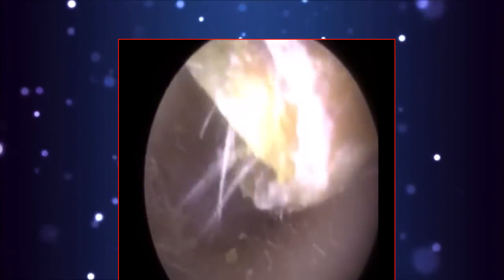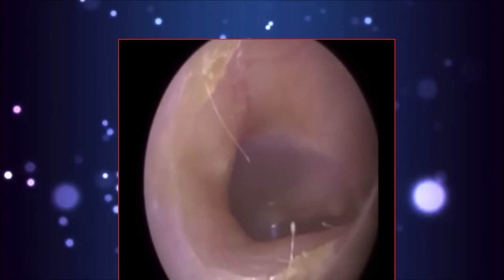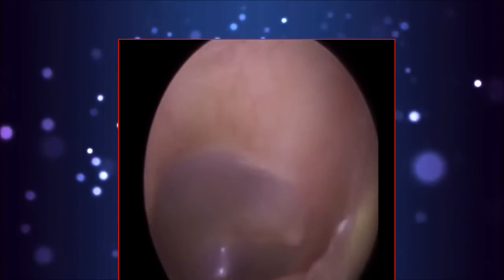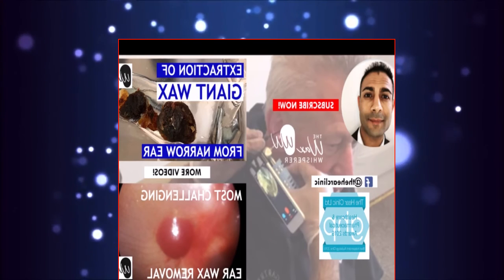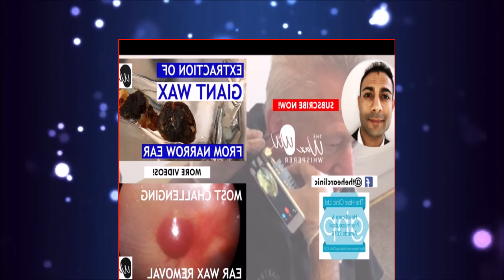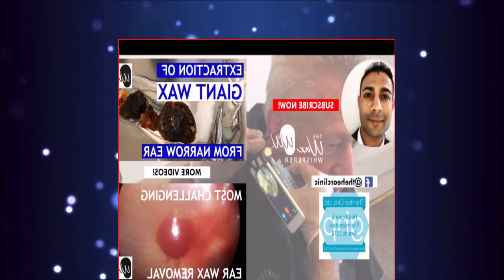So we're not only having to enter a very small chamber, a very small orifice. Remember that the Zollner suction probe is 2mm diameter. The endoscope is 2.7, so that's almost 0.5 centimetre already. So we've only got a couple of millimetres here and there, give and take, and then the ear's bendy, so we have to stretch it, widen it. Almost like we use the instruments as a crowbar to widen the ear.